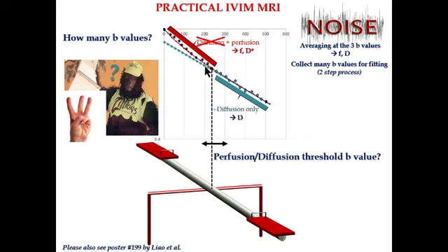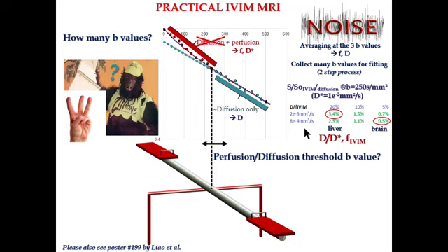The problem is, where is the threshold? Where is the border between pure diffusion and diffusion plus perfusion? That's an open question, and of course, it's very important to decide.